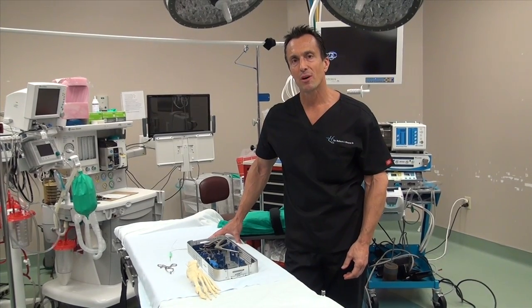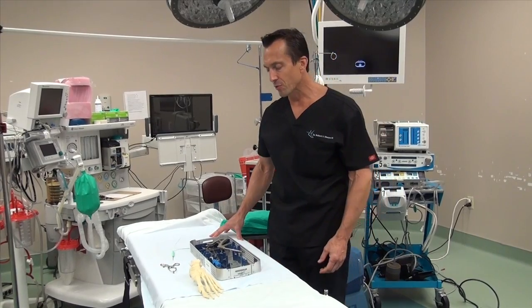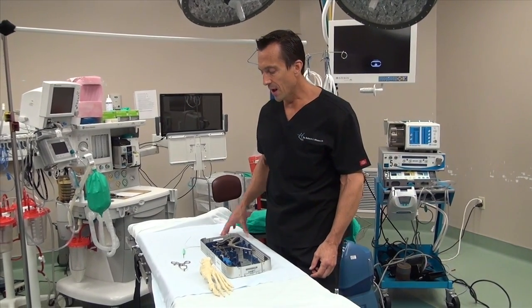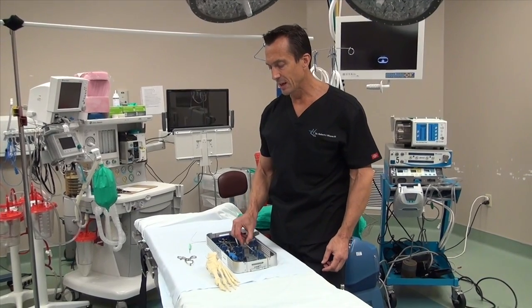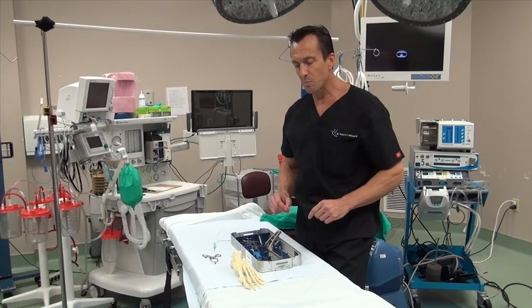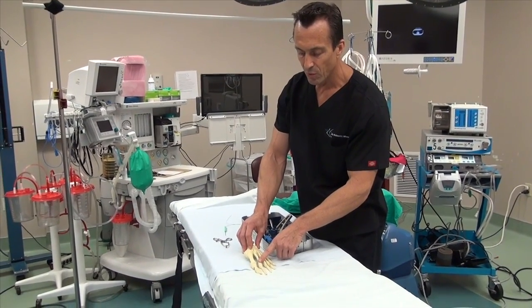Hi, this is Dr. Moore and today I'm going to talk about another great device by the company Arthrex called the plantar plate repair system. This system has a complete kit with pre-packaged entities and it's mainly designed to fix the plantar plate rupture.